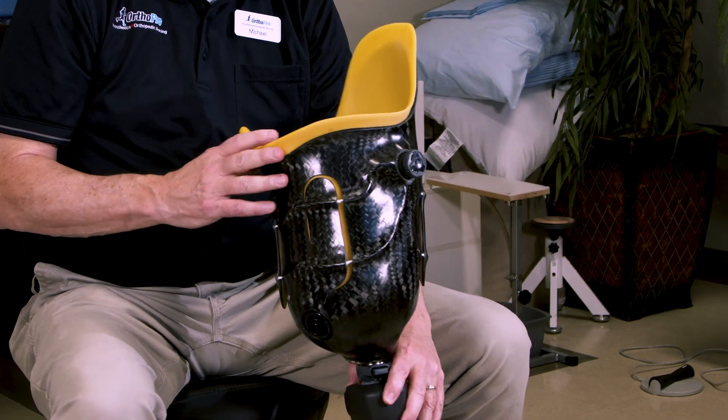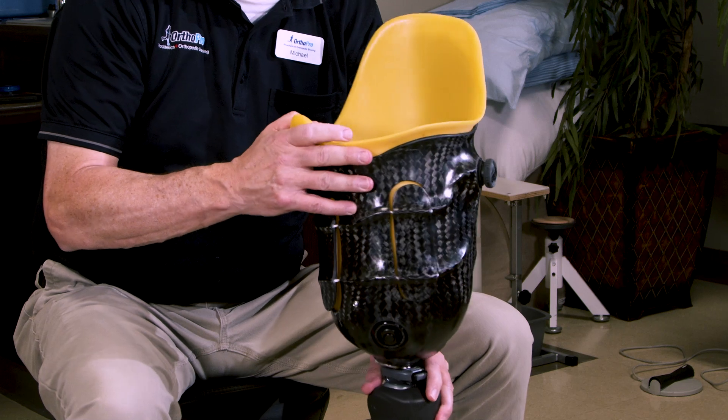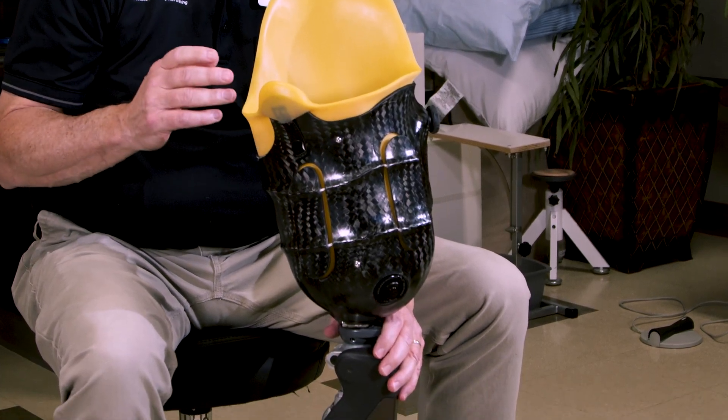Hi, I'm Michael with OrthoPro and I'd like to show you a prosthesis that has some features to it that help people a lot. This particular prosthesis is for someone with an above-the-knee amputation or a transfemoral amputation.